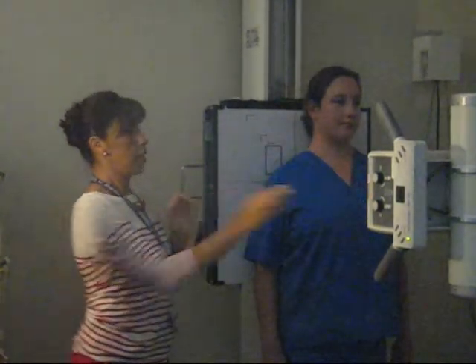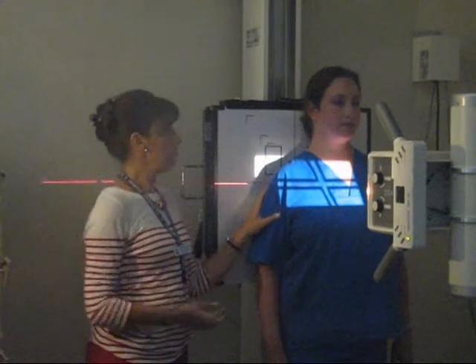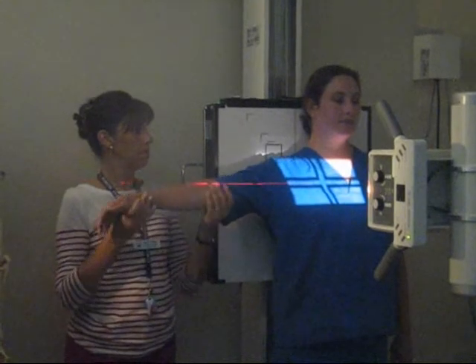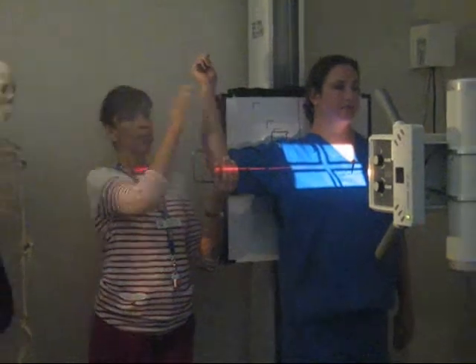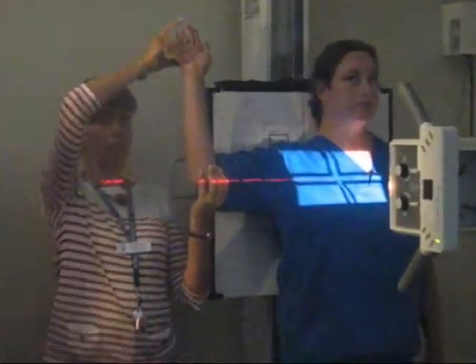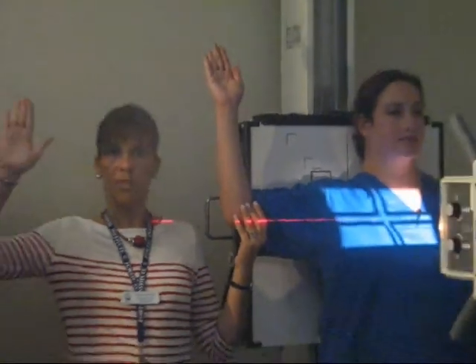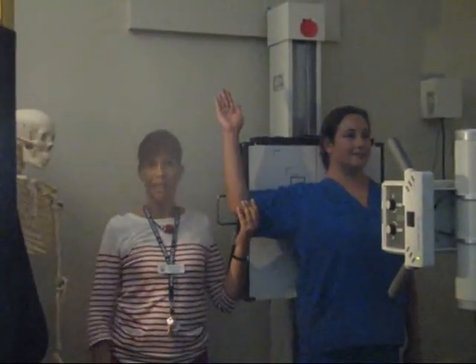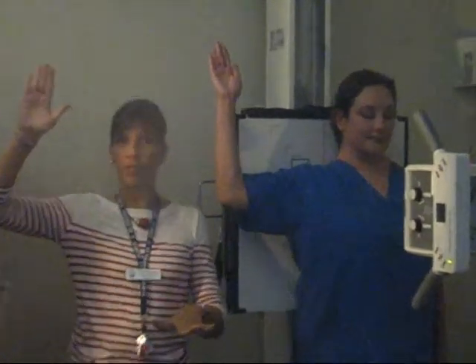Okay? Now, in order to move the scapula and move everything in a way that we can really see it, we're going to abduct the patient's arm about 90 degrees and flex the elbow with the palm of the hand to the front. We call this the "I swear" or "allegiance" position, whatever you want to call it. But if you want to think about it, you swear on the Bible when you're in court, when you put your right arm up, that's the position that you use.